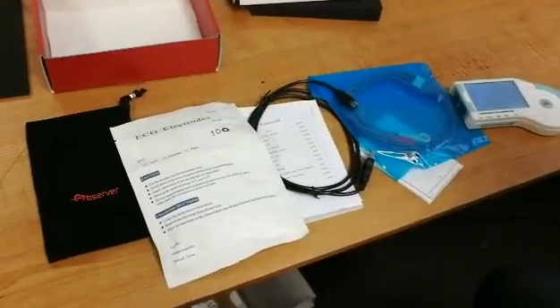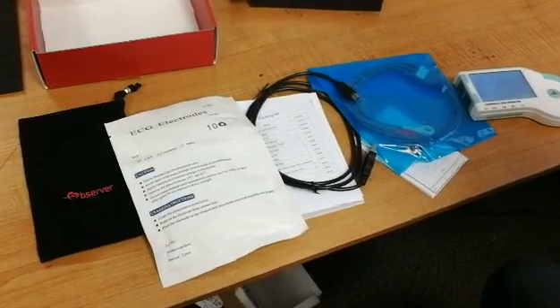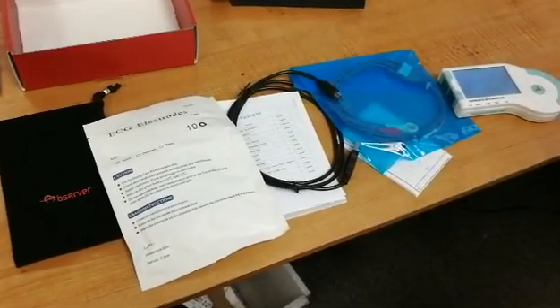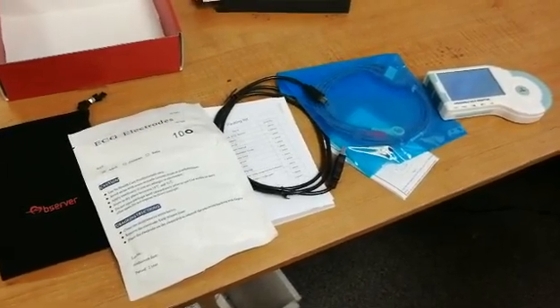Today we will be previewing the FL-20 ECG monitor, which comes with a carrying case, ECG electrodes, user manual, and USB data transfer cable.